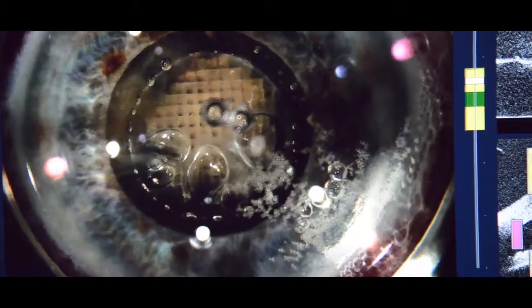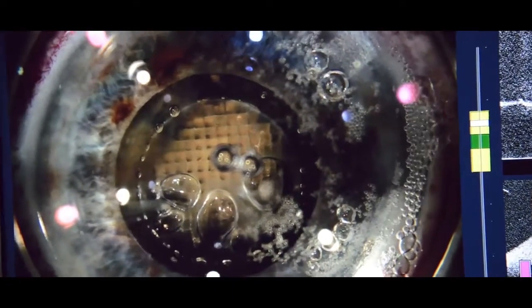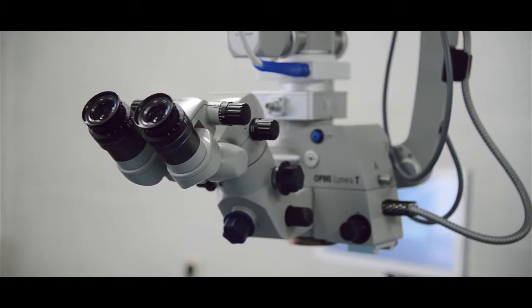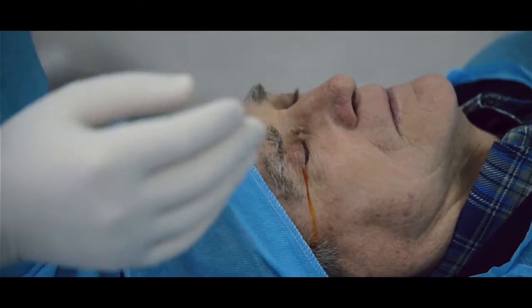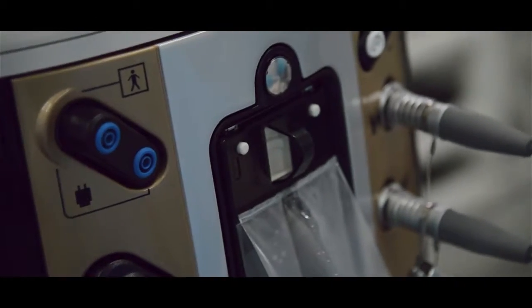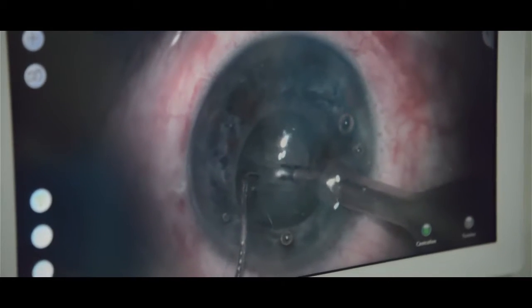After completion of the entire laser emission procedure, the vacuum suction was removed and the patient was transported to a day surgery operating room. The laser step of the surgery accomplished with the Verion Image Guidance System and femtosecond laser was followed by the next surgery steps performed using a modern ophthalmological equipment complex. The nucleus was then separated along the femtosecond cleavage planes and aspirated with the phacoemulsification probe.